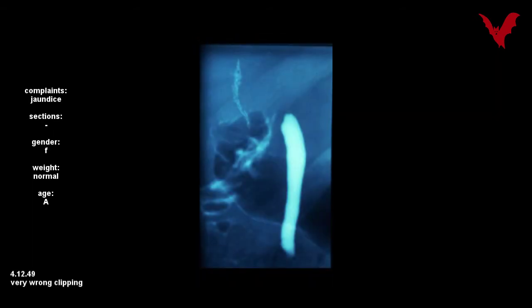Shortly after laparoscopic cholecystectomy, this bizarre complication in 48 needed EST. Two cases shortly as well after laparoscopic cholecystectomy. These cases 49 and 50 show a catastrophic result of the operative intervention. The false tubular structure had been clipped.